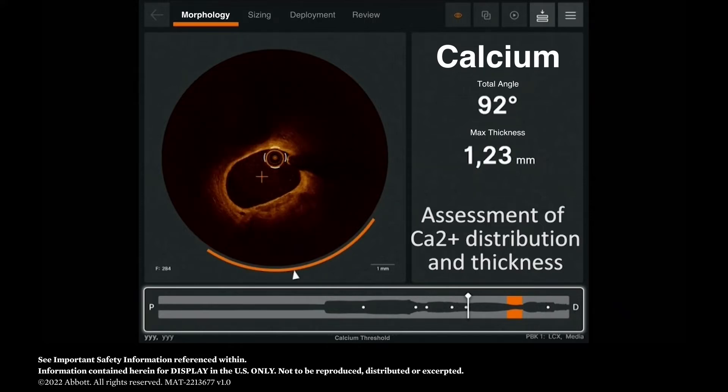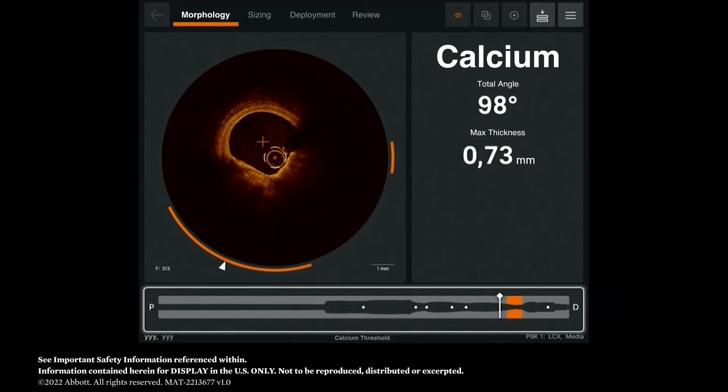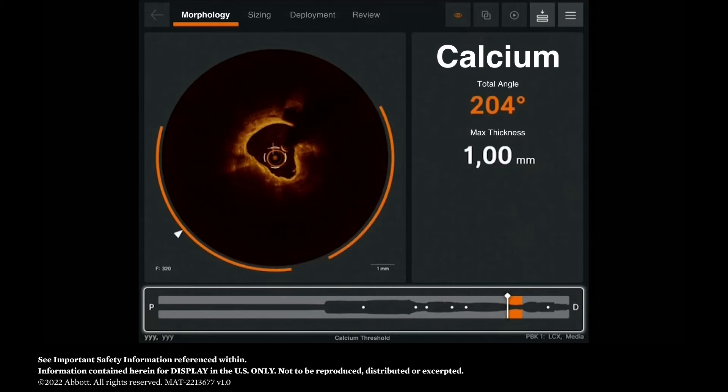And you can see here how the system really provides an analysis of calcium that includes the arc of the calcium that you can see, and also the thickness of the calcium, the maximum thickness of the calcium in each frame. And those are of course very relevant aspects to decide whether a lesion really needs special plaque preparation or just normal predilation.